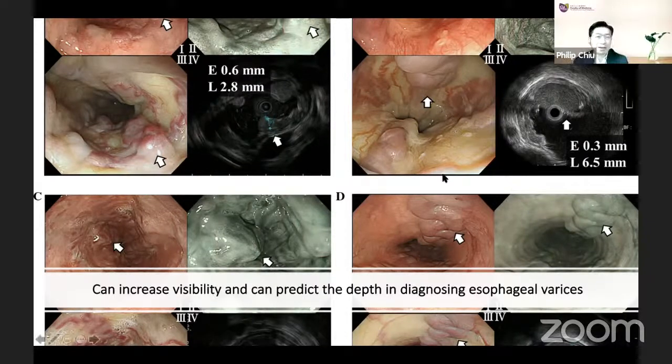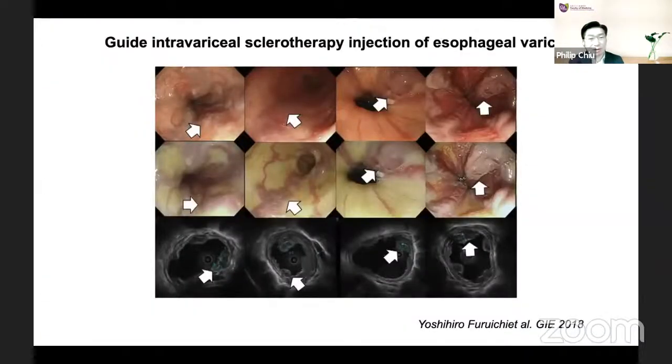Yeah, I think at this moment, of course, the application of RDI is excellent to identify the bleeding area, and especially when there is active bleeding. But I think in the future, some of the investigation or research might be focusing on the management of GI bleeding, or especially also on the identification of variceal bleeding point, where, as mentioned earlier, we may be able to see deeper vasculature.